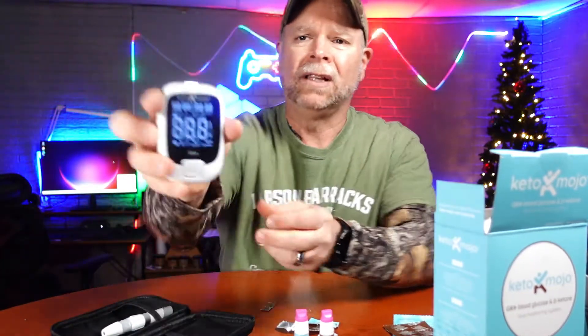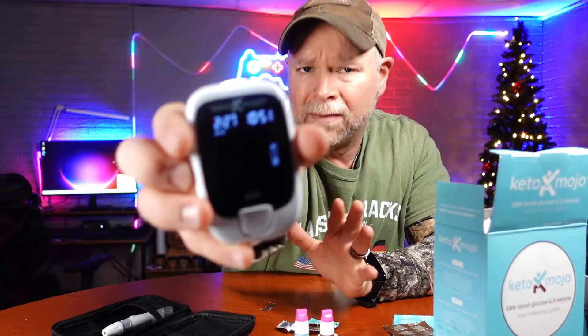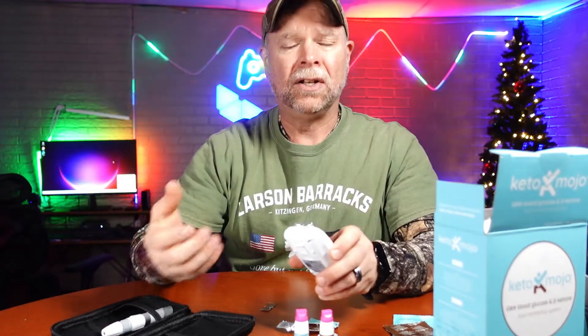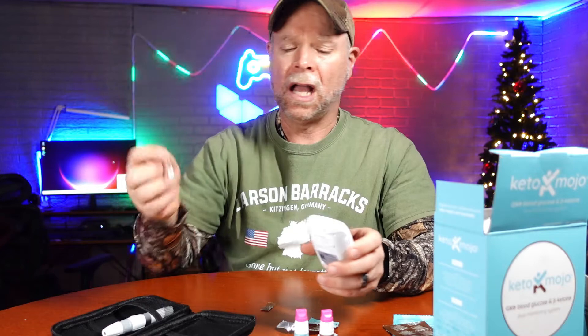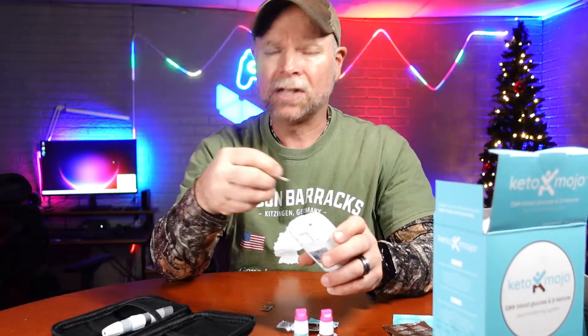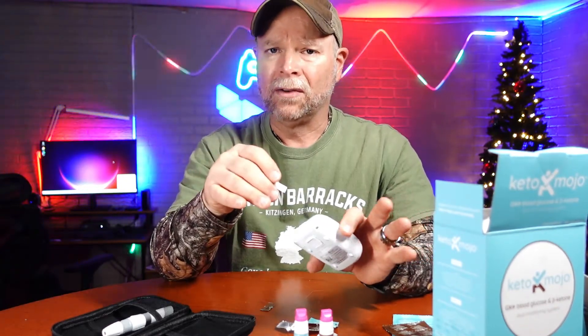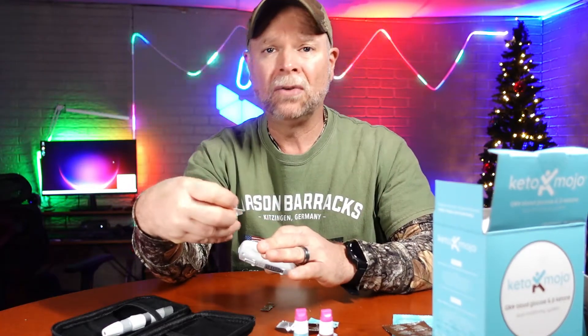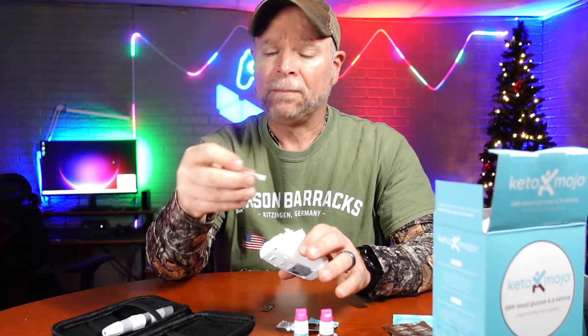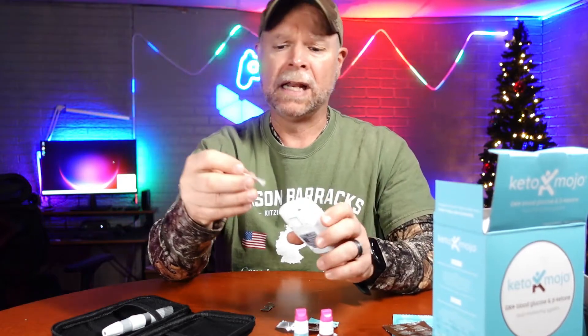Your reader machine does have a lot of information on it, but personally I have not had to worry about most of those things. All I did was set the time and the date, and then all I do is stick the test strip in. I don't worry about any of the other features. I want to see my blood glucose, I want to see my ketones, and then I want to go to the app and check my GKI — my glucose ketone index.